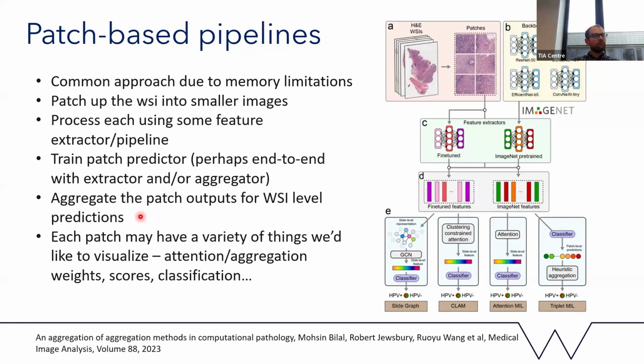And so each patch might have a variety of things we'd like to visualize associated with them. It might have scores, probabilities, classifications. It might have attention weights or some other aggregation weight.